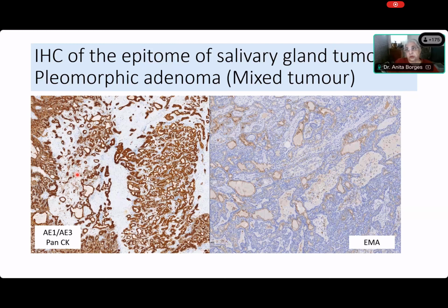So both luminal and abluminal cells, in other words, the myoepithelial cells and the epithelial cells, are positive over here with pan-CK. But it is exactly the opposite with EMA. What do you see in EMA now over here, Madhu? The luminal cells are showing positivity. Luminal cells, yes. So the luminal cells show it, but look at all the myoepithelial cells, and there are so many. You see all these basaloid cells?